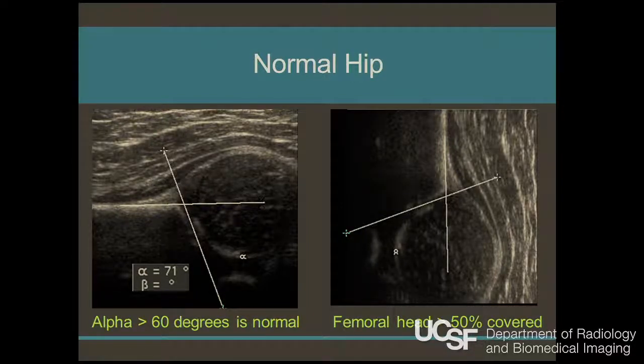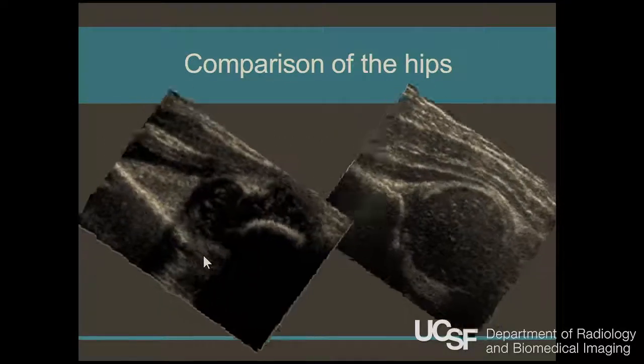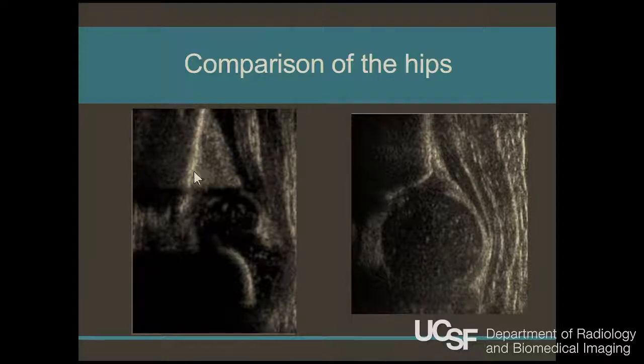But you can't make one that's 62 look 55. So just a good tip to remember. In this case, this is that iliac wing here. I'll turn it on its side again. This was that iliac wing. There was no acetabulum. This thing is fully dislocated here, and it was sliding up along the iliac wing there.